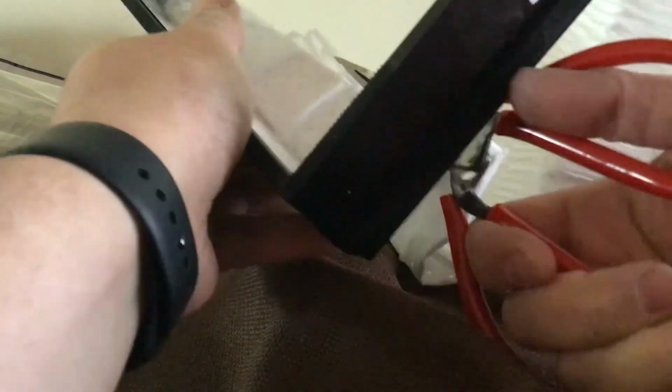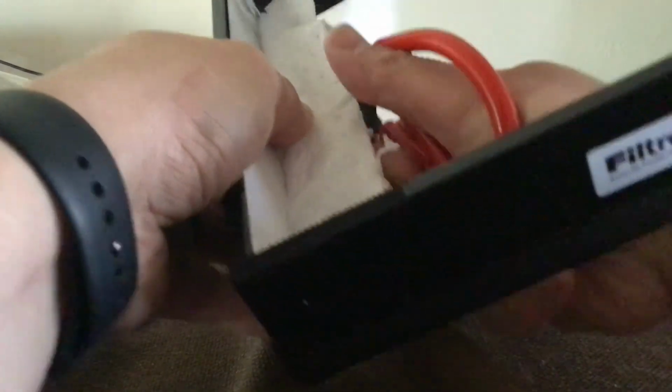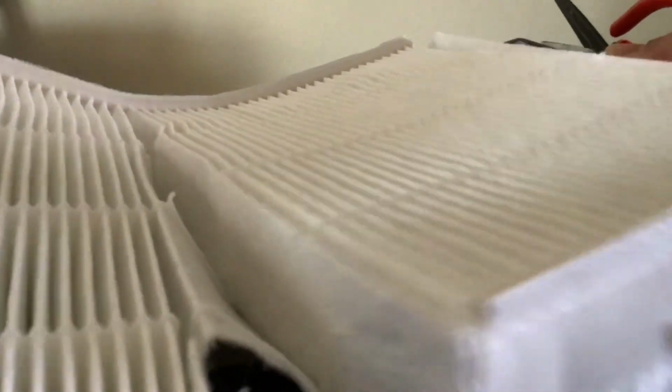Making certain I don't cut my tablecloth. There's one side done. Now for the other side over here. Alright, and that's the filter freed from its frame.